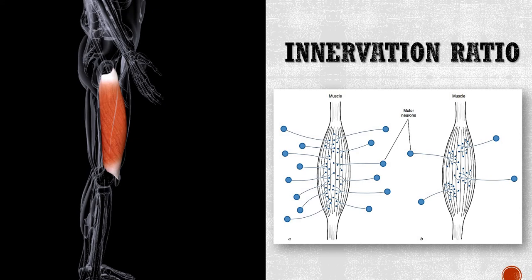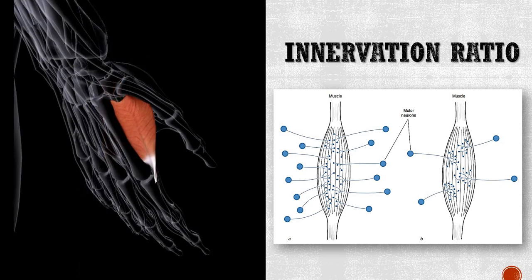Now, if we look at another muscle, and if anyone would like to guess at any prior, I can't give you a prize, but I would if I was there. Any prizes for anyone who wants to guess the name of this muscle? You can actually palpate it if you extend your fingers and thumb and just apply a little bit of pressure with your other hand to the fleshy region between your thumb and your index finger.